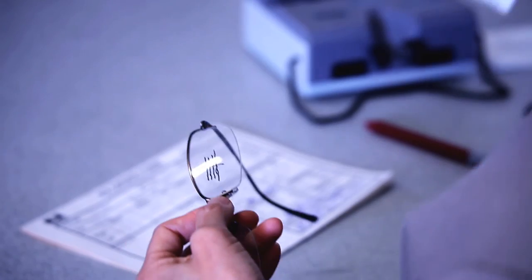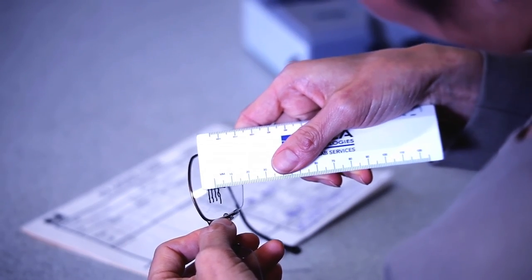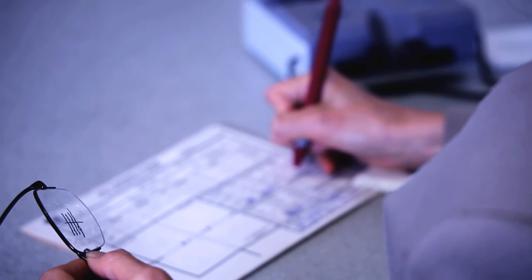You can take the frames off now and I'll do one final measurement. The heights should be measured relative to the deepest point on the lens at the peak of the bevel. Order the lens position according to your monocular PD's and the heights according to the final positioning of the markings.